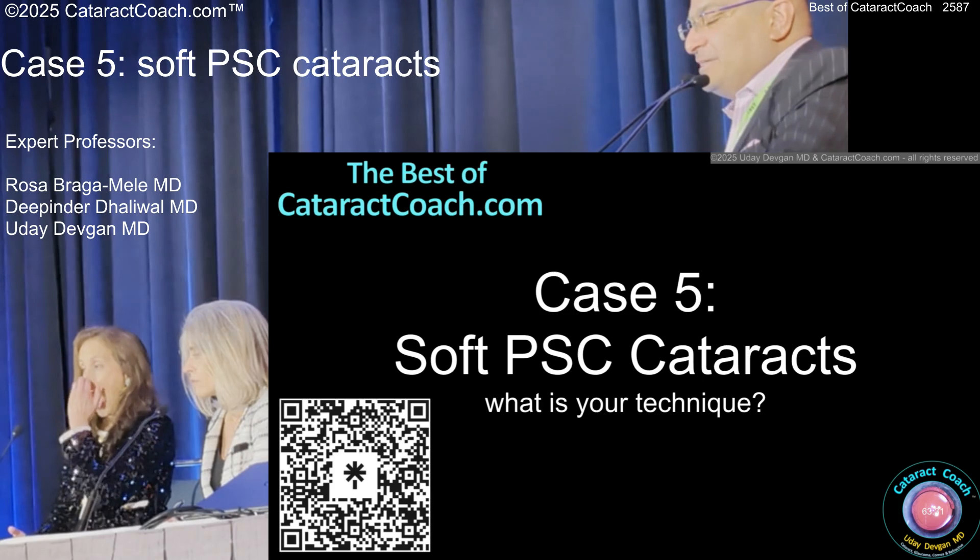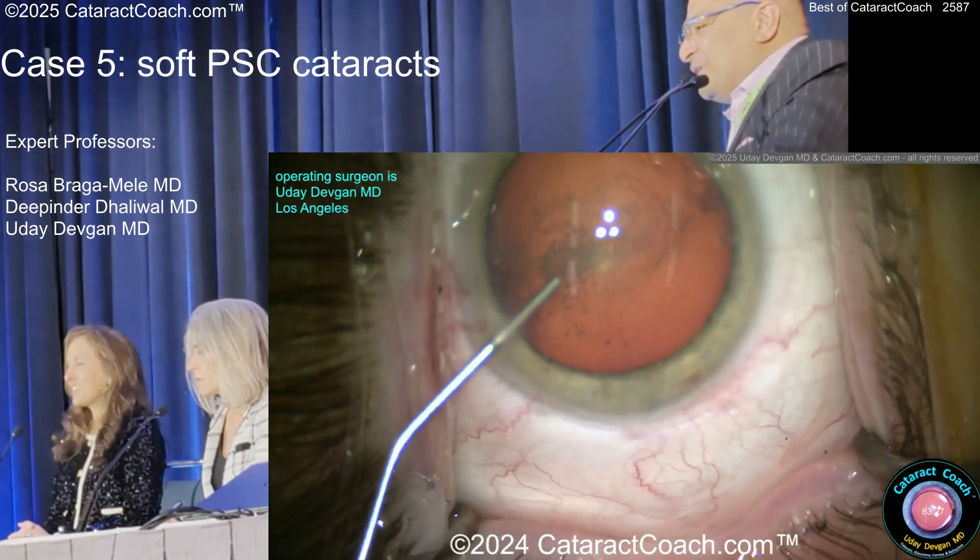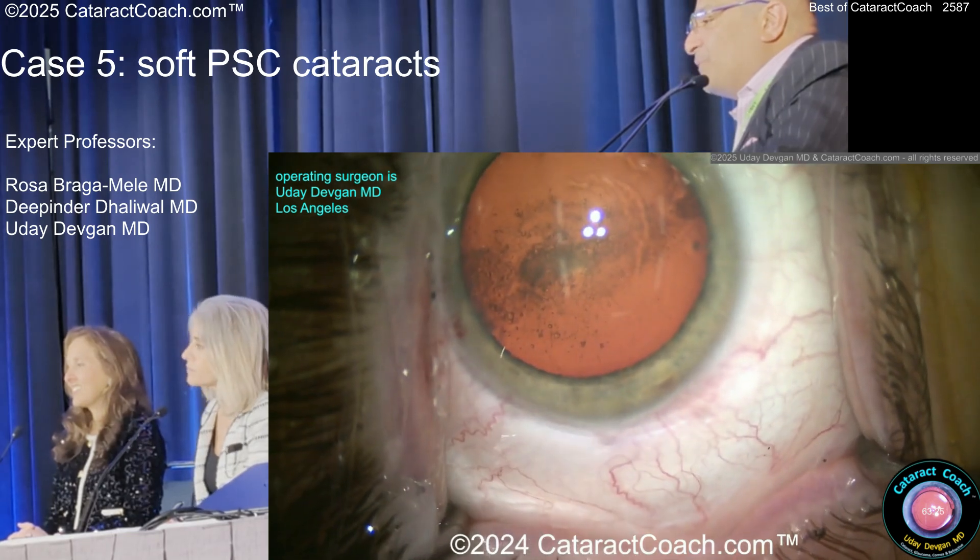Soft PSC cataract. You're going to really scold me for this one. I've got a good one coming up here. Typical case, looks pretty straightforward, right?